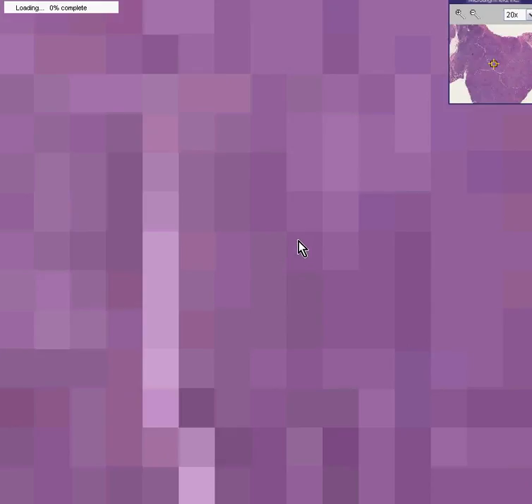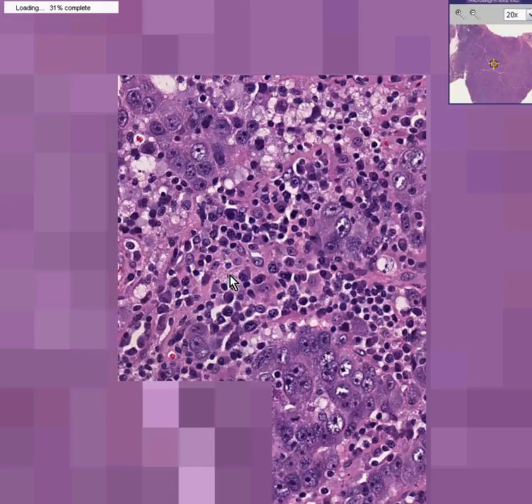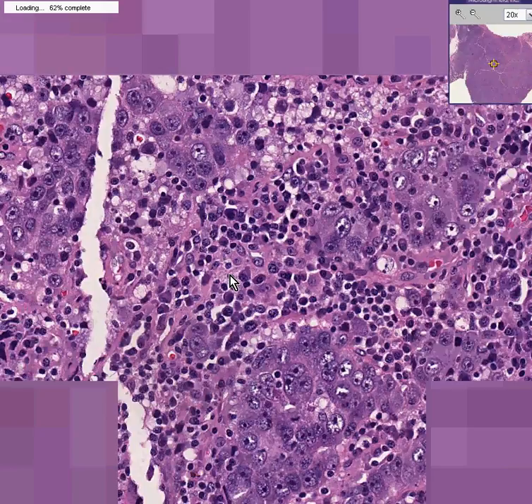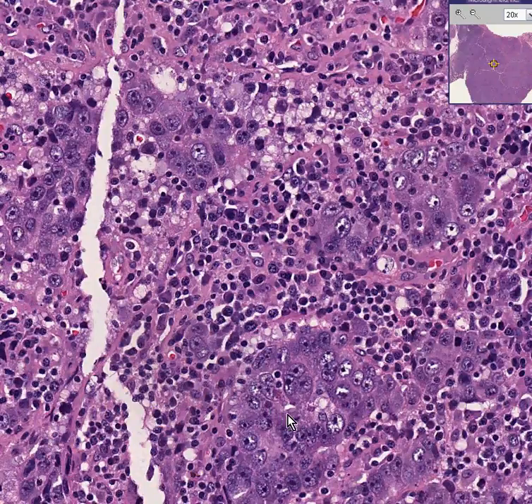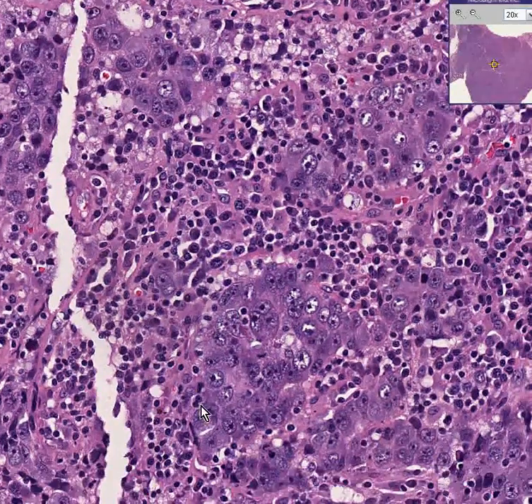It's not like lobular carcinoma or some of the intraductals when the nuclei don't look terribly bad. You should be able by now to look at little clusters of cells like this and just instantly say malignant. They're big, they're irregular, they're dark. They have nucleoli that are about as big as your basketball, but there are probably even a greater amount of lymphoid cells surrounding this. And of course, you know this is just a little crack artifact.